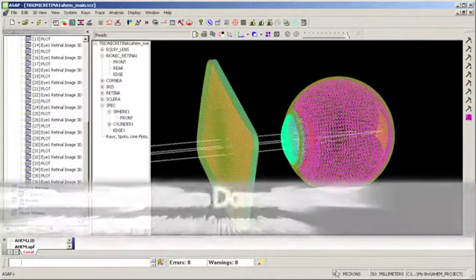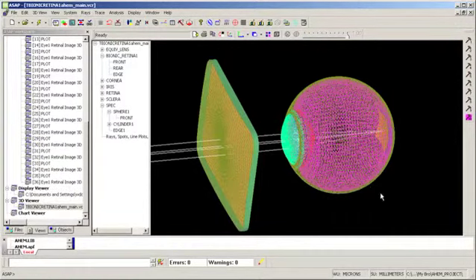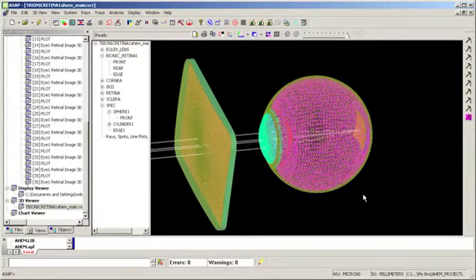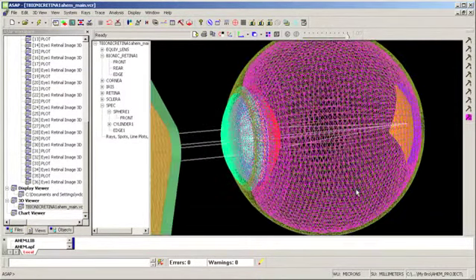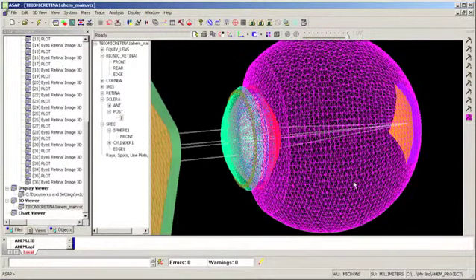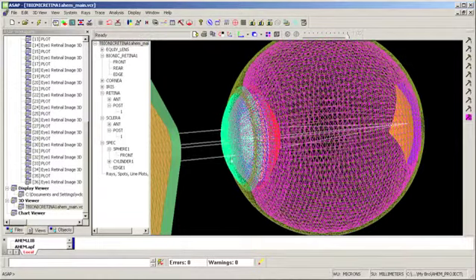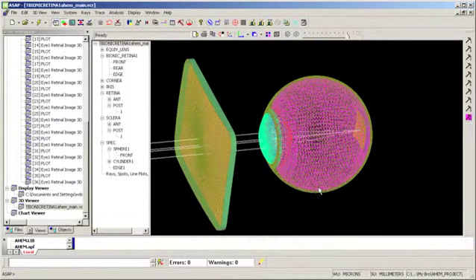Right, now I'm going to use the eye model to simulate a retinal implant. So we're looking at a graphic here of the eye model and also a corrective lens in front of it, because if we put an implant in the eye, let me zoom in on it, you can see the retinal implant, and let me hide the sclera and the retina. You can see that it sits inside there and has some thickness to it. So that's why we need to have a correction in front of the eye.